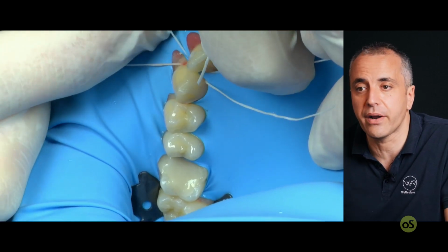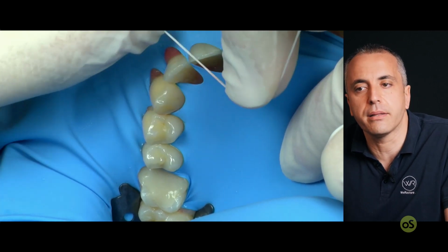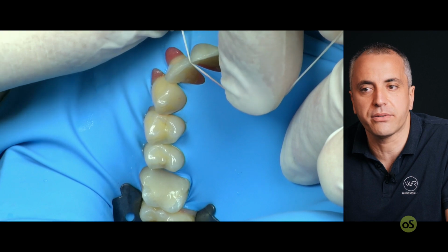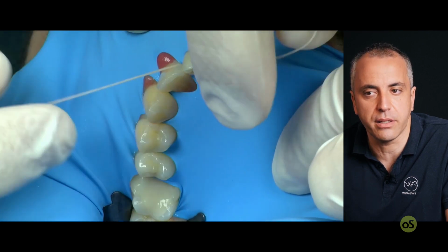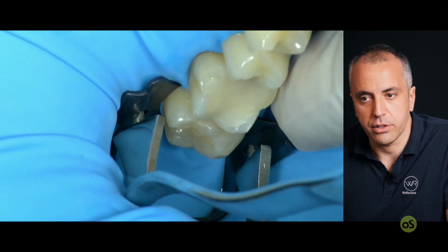Generally in the anterior area it's easier. In this case it was quite hard. The contact areas were quite strong, even in the anterior, as you can see here. But with a little patience we can obtain a nice isolation.